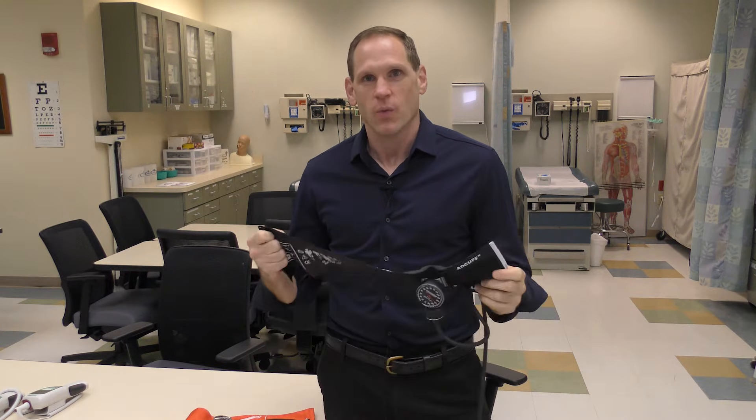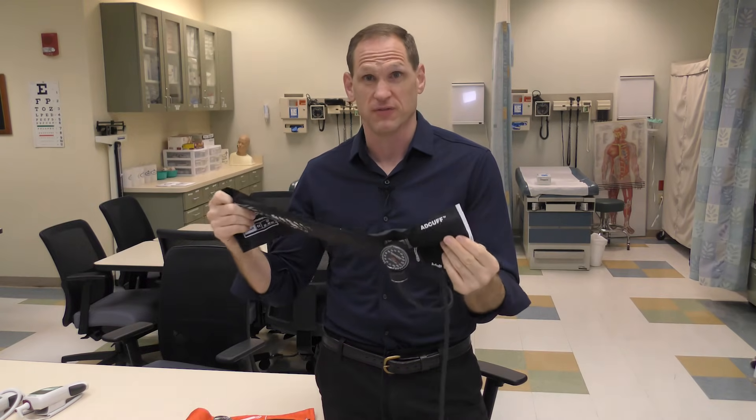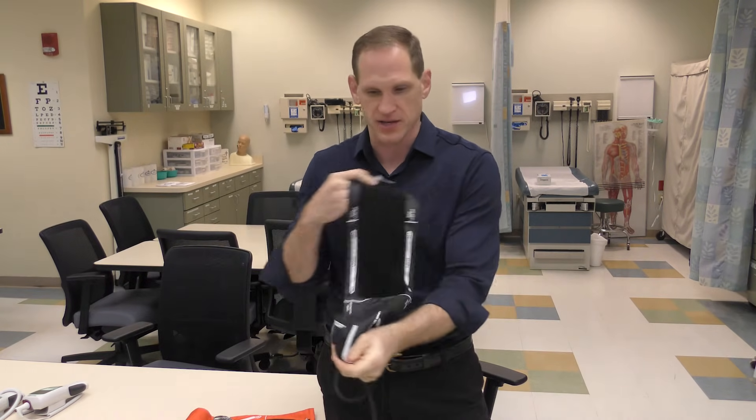Today we're going to talk about blood pressure. When you take a blood pressure you're going to have to use a cuff, and the most important thing when you get started is using the right size cuff.